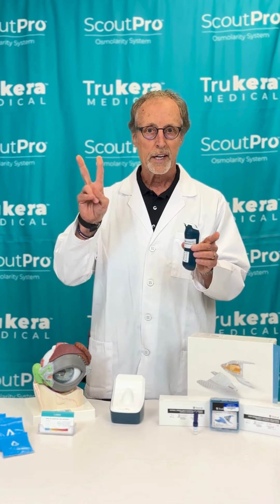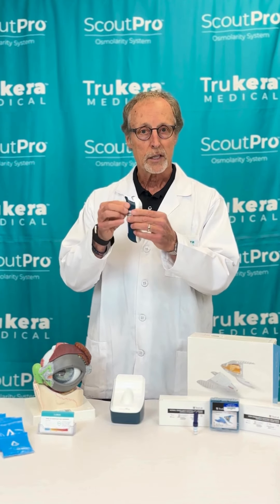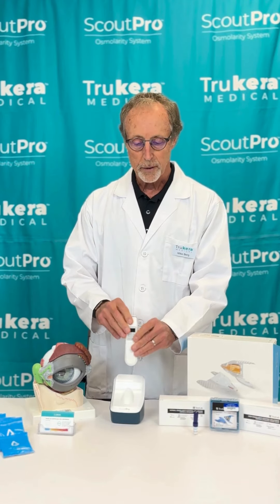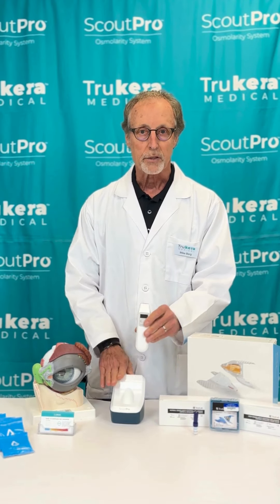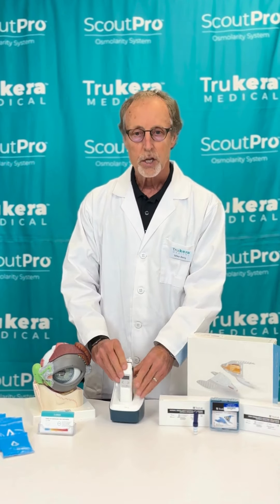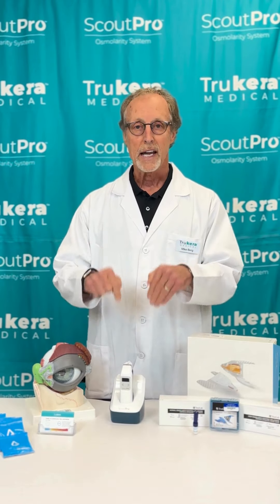The second reason you can get an ER message is that after you do get a collection, before you get a test result, do not put the pen back into the charging base. If you put the pen back in the charging base before you get a test result, you will get an ER message.